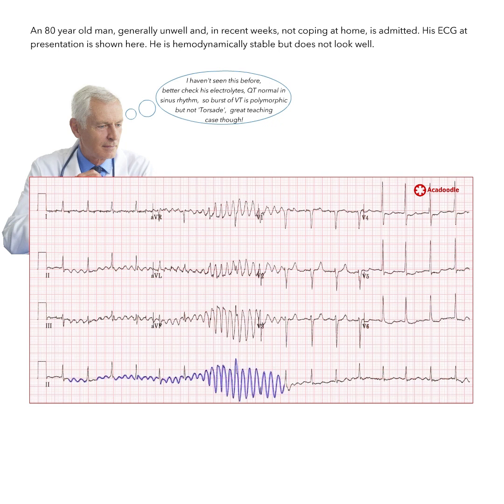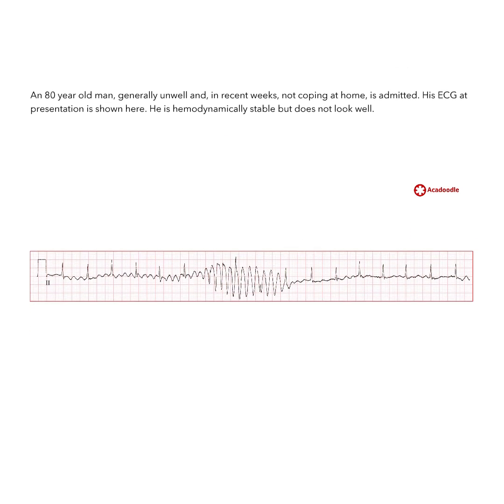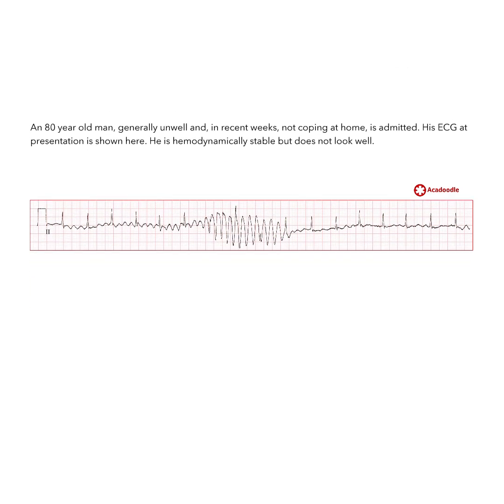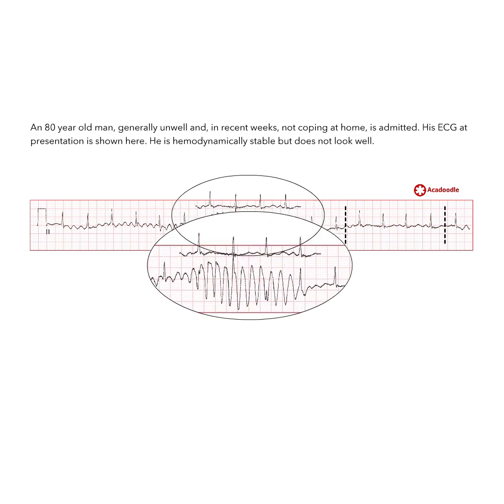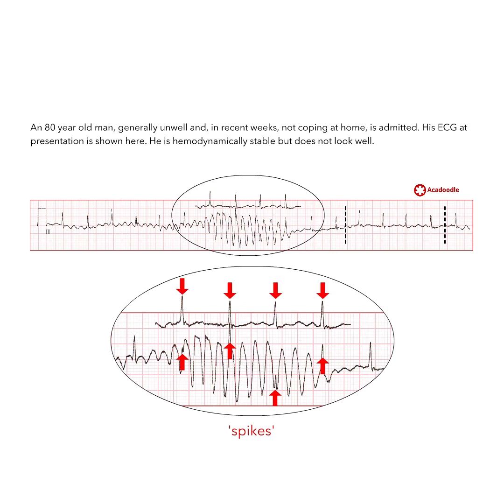This undulation of the isoelectric line is in fact artefact. If we take a portion of the readout from a part of the ECG unaffected by these distortions of the isoelectric line and use computer graphics to correct for a slight sinus arrhythmia, we can see that these spikes occur at sites where we would expect to find R-waves in this lead. These are in fact R-waves of the underlying sinus rhythm with artefactual distortion of the isoelectric line.